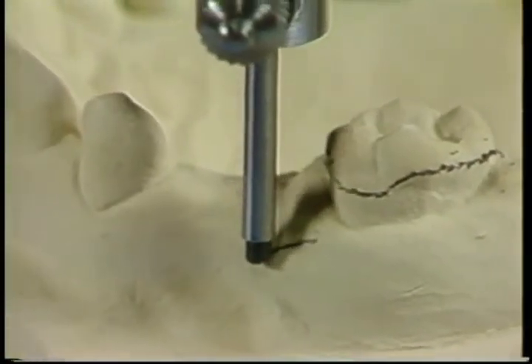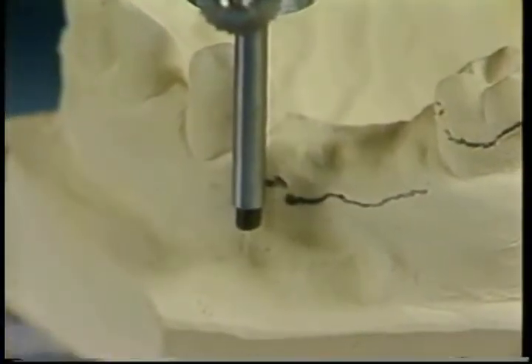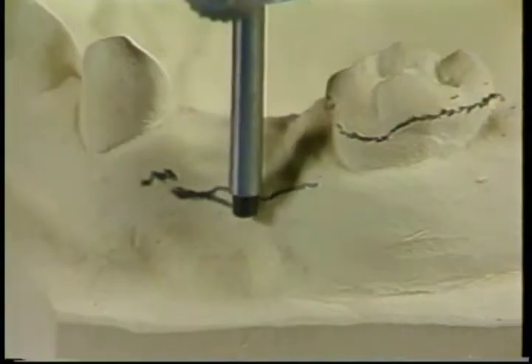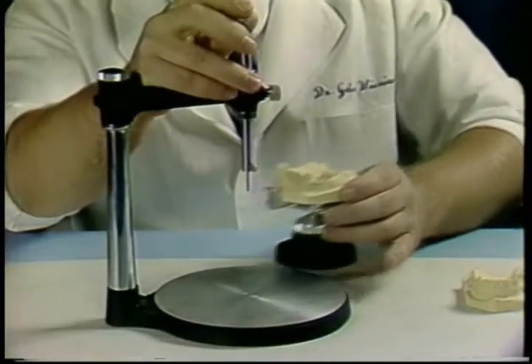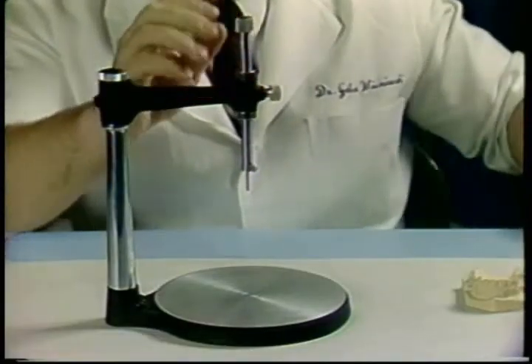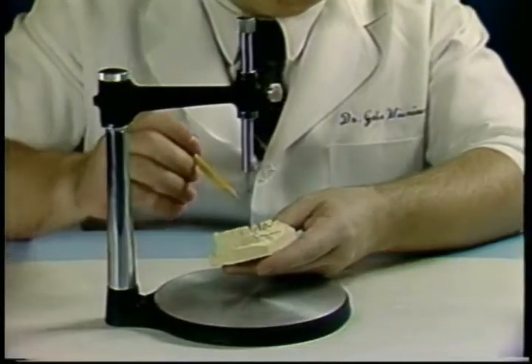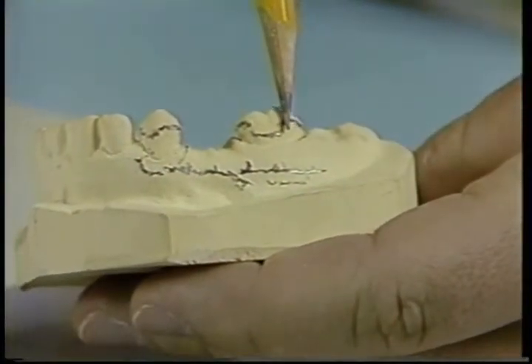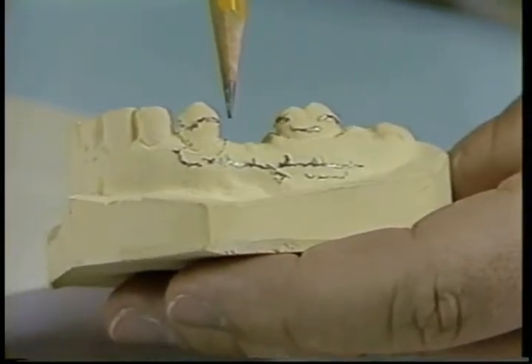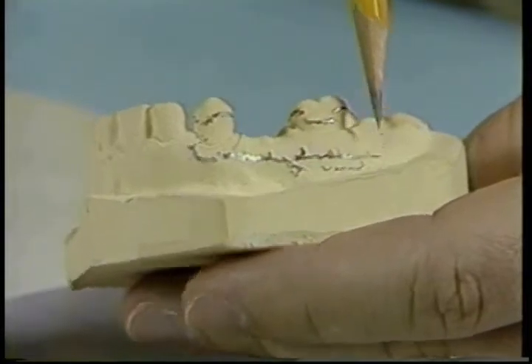In addition, the example shows marking the height of contour of the bony exostosis, which may provide an area of interference. The illustration now shows the heights of contour have been marked on each abutment tooth, as well as the bony exostosis.